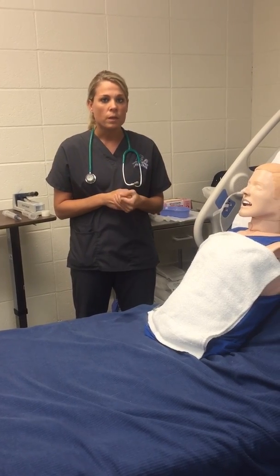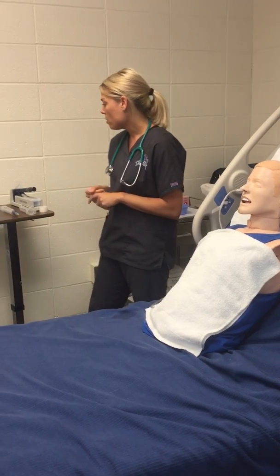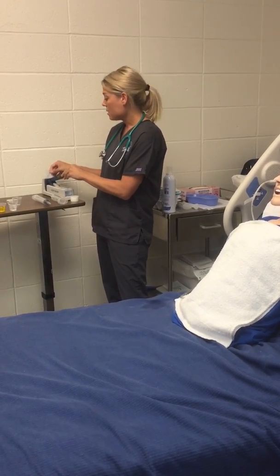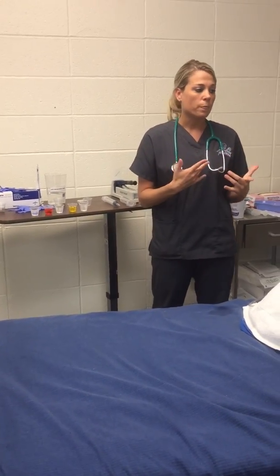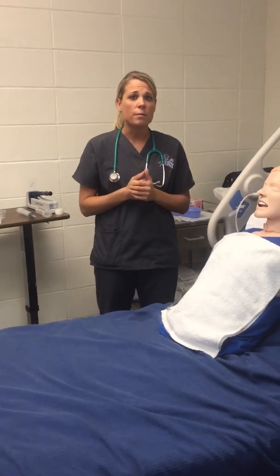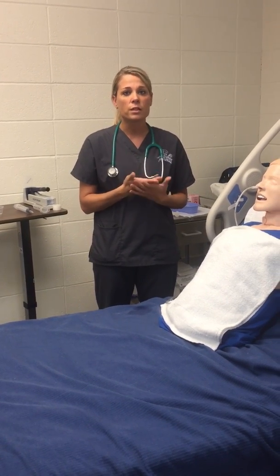administering the medication. So for video purposes, I've already crushed up my pills and put the crushed pills in 20 mils of sterile water and swirled it around and let them sit there. So now what I'm going to do is assess my patient. I'm going to assess if he's on any continuous tube feedings because we want to discontinue those for the time being.